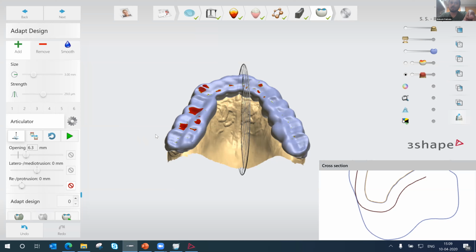So you're saying you made the splint and printed with Asiga and another printer, but the quality is not good. After 3 days, the patient is using the splint and it's broken. So I cannot tell you from the software division, because if that splint is broken after 3 days of use, you need to check with the printer. But I feel like Asiga is a good company. But yes, you can just check with the companies as well.